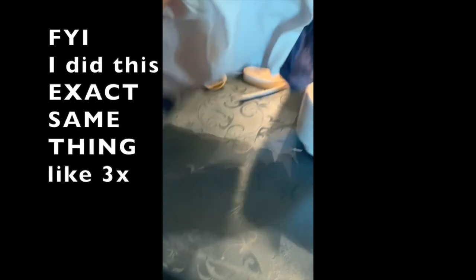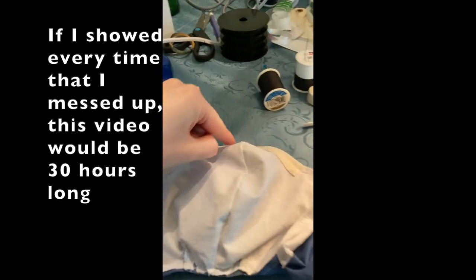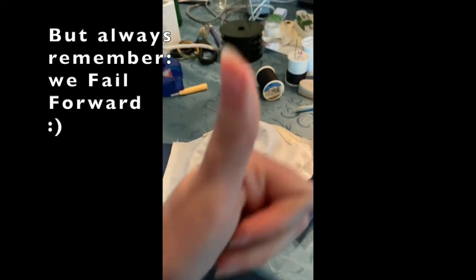Oops — sewed it wrong. Inside out. Going to have to seam rip all of this and do it again.